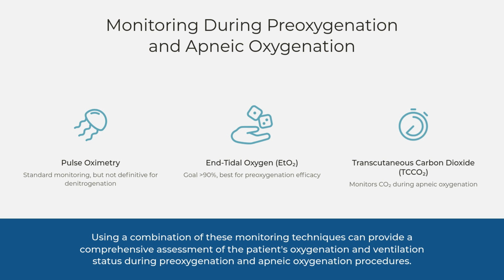Monitoring during preoxygenation and apneic oxygenation. Monitoring is essential to ensure these techniques work effectively. Pulse oximetry, measuring peripheral oxygen saturation, is standard, but can be misleading.